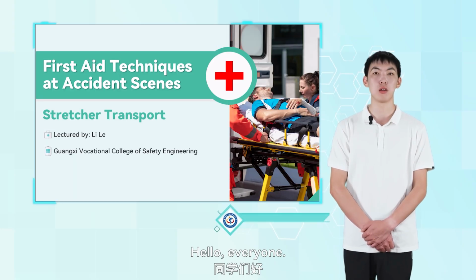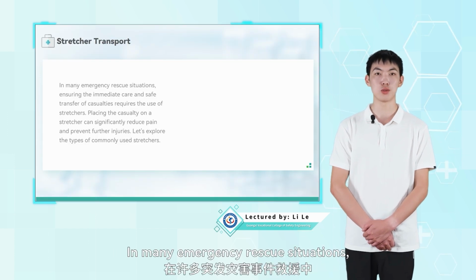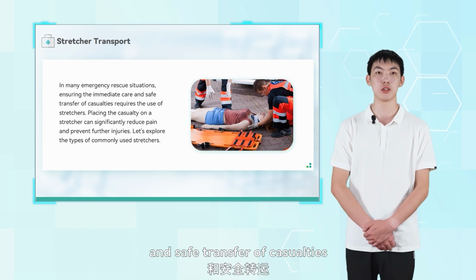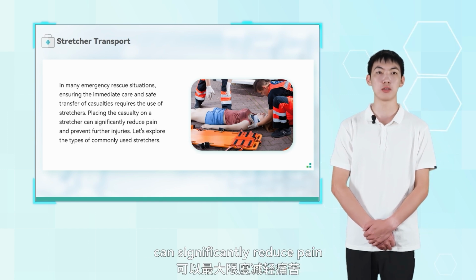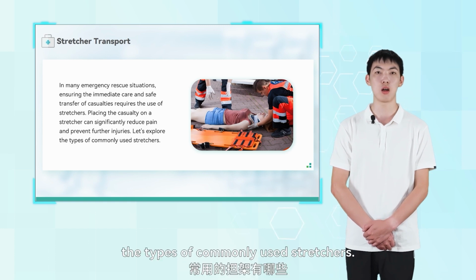Hello, everyone. In this lesson, we're going to explore stretcher transport. In many emergency rescue situations, ensuring the immediate care and safe transfer of casualties requires the use of stretchers. Placing the casualty on a stretcher can significantly reduce pain and prevent further injuries. Let's explore the types of commonly used stretchers.